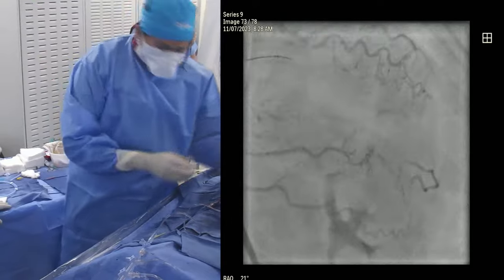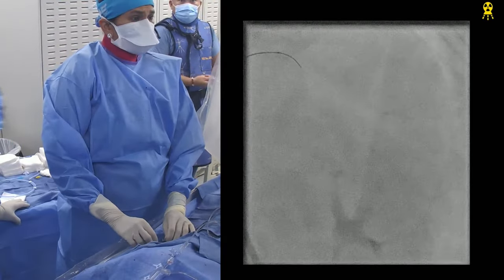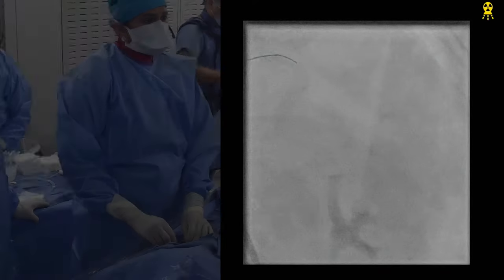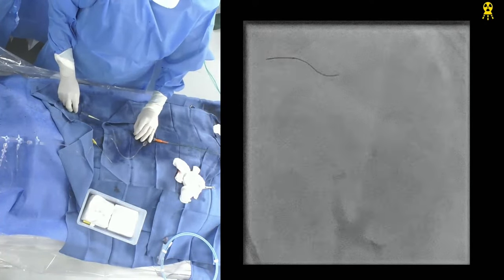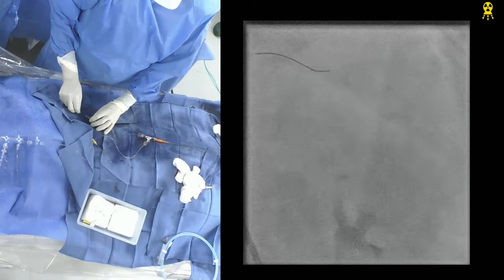Miracle 6. The Fielder clearly did not make turns. You need a little stiffer, get a Miracle 6. No, I don't know. Stiffer or... Now you can bring your... That's where it was. Little further. Yeah, it looks to be going to the diagonal. Yeah. No, even there, it's not making a turn. Not making an easy turn.